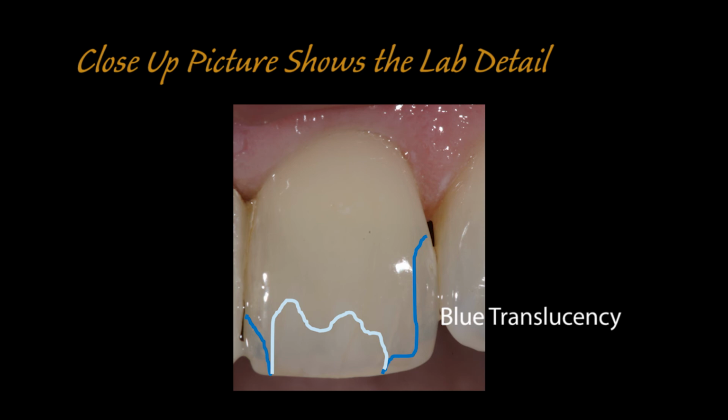Now you reference that with a good shade guide picture. You really arm the laboratory with all the tools that we need for success, basically to give that patient a rock star type appliance or a prosthetic that they're really proud of, and you and I are very proud of. And that's how we grow our businesses.